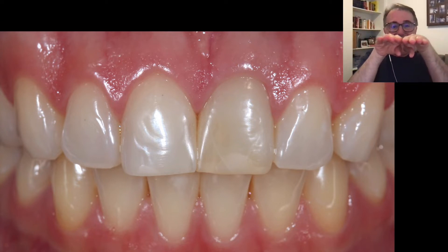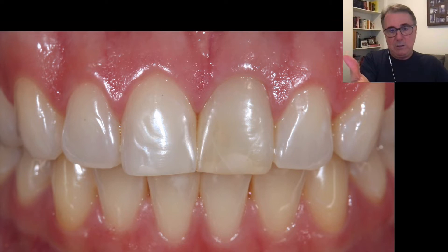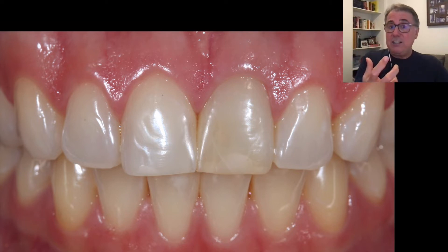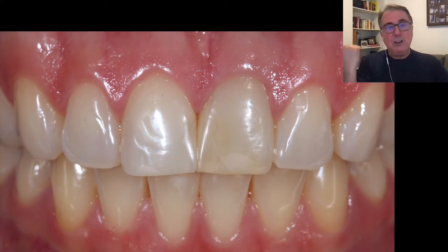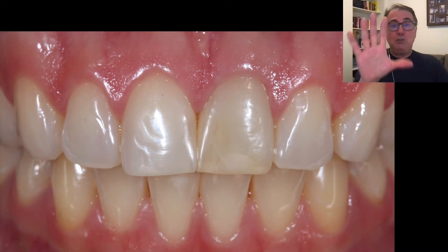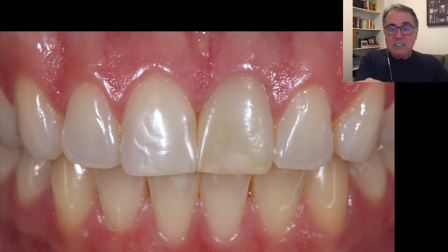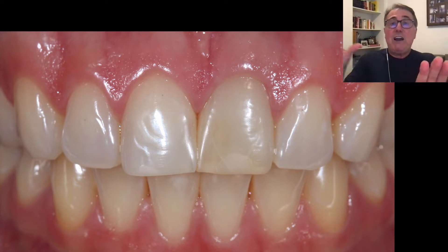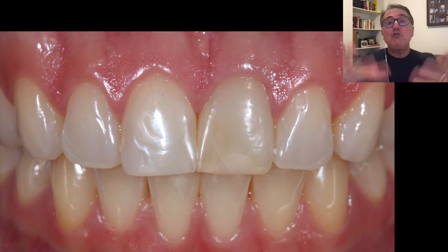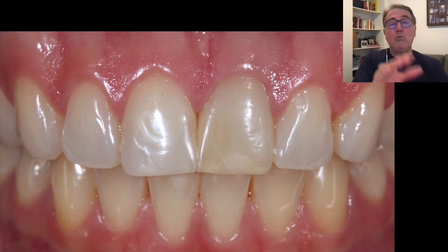Both centrals are exactly at the same level, so I can't put anything on top of that tooth without preparing it. There's a challenge here, because I need space so the lab can make the veneer, but also, the more I prepare the tooth, the darker it will appear — because the color of the tooth is within the dentin. If I remove enamel, the dentin will show through even more.